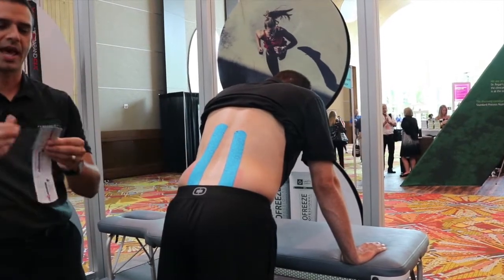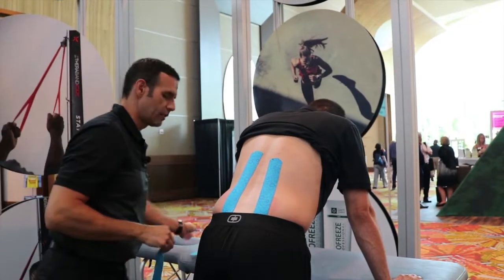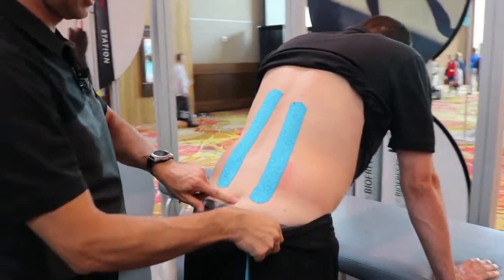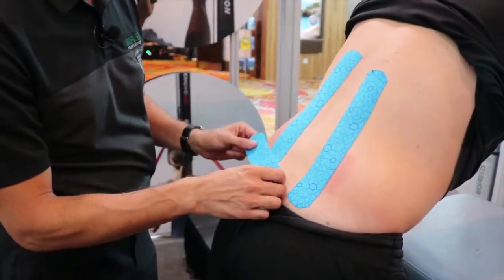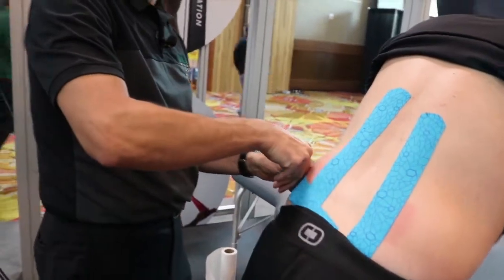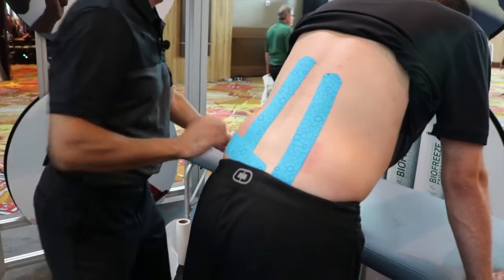Once again, we fold it in half, cut the 2 edges. Now, it doesn't matter which side you start on. We're just going to bring back his pants just a little bit to get his sacrum exposed. We'll start right on that left side. And all we're doing is just peeling off the tape at paper off tension.